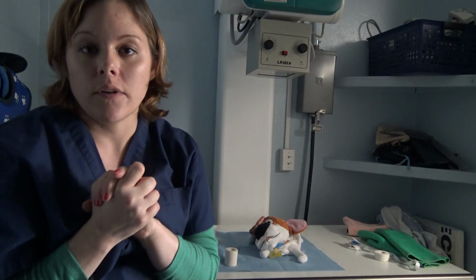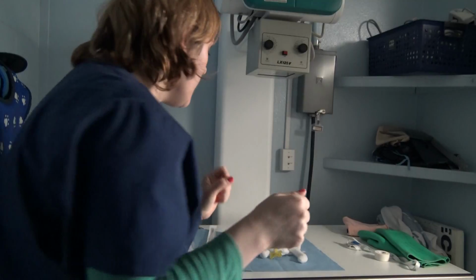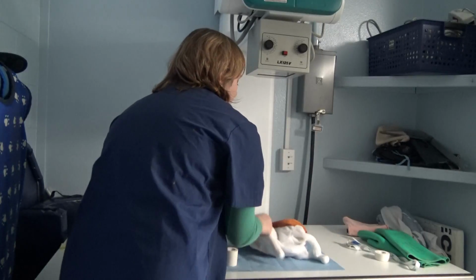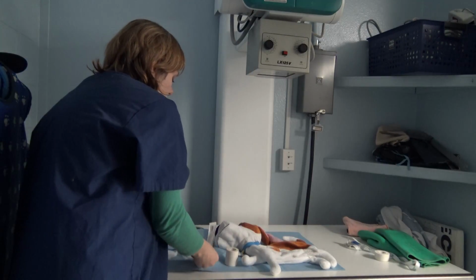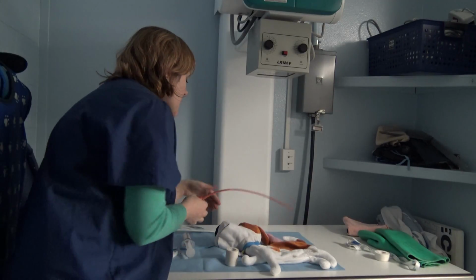So before you ever do a stomach tube, you want to make sure that you have the right positioning. So we're going to go ahead and have our patient restrained in a lateral recumbency. And we're going to measure from the tip of his nose to the last rib, or the 13th rib.